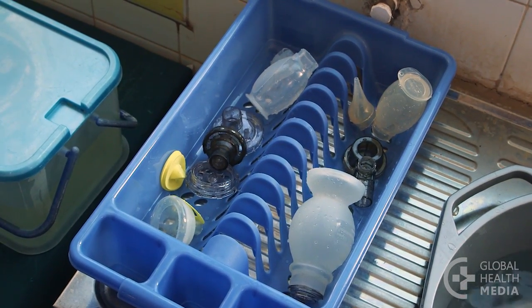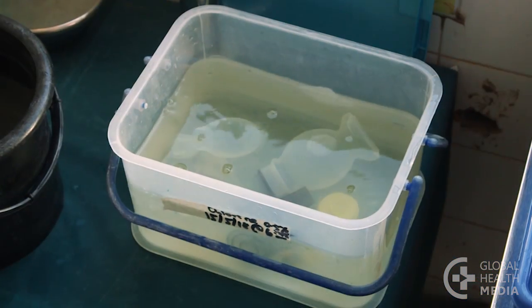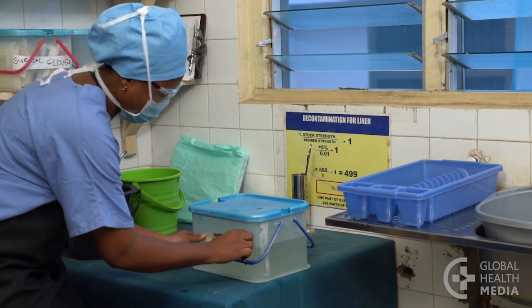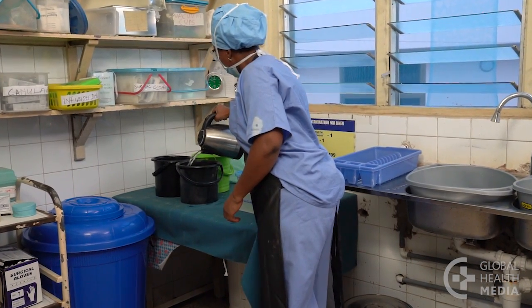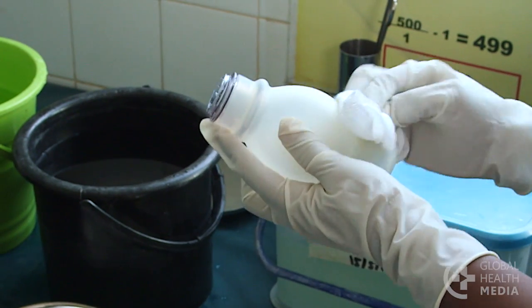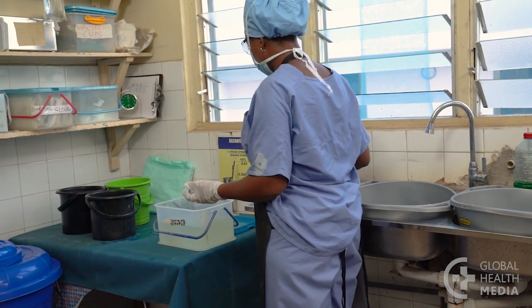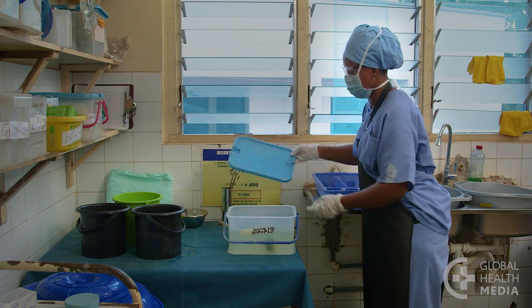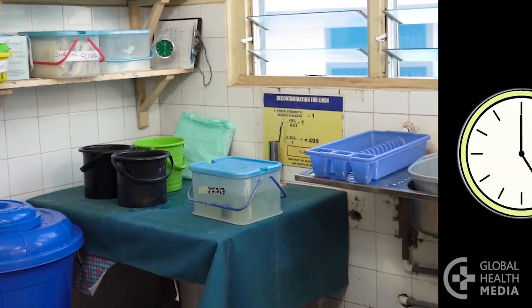Now the equipment is ready for disinfection with a chemical solution such as chlorine. Be sure to dilute the chlorine properly to make a 0.5% solution — make it fresh that day. Label it with the date and time. Also prepare three buckets of boiled and cooled water for rinsing. First, dry each piece inside and out to avoid diluting the chemical. Then immerse them in the container of chlorine. Be sure all parts are completely submerged and none are floating. Cover the container, start your timer, and soak the pieces for 20 minutes in the chlorine.